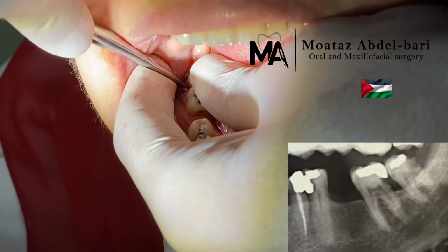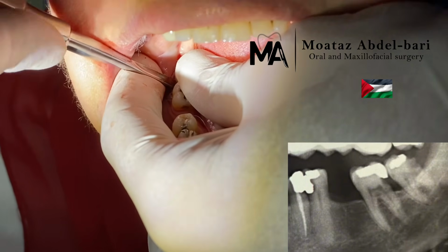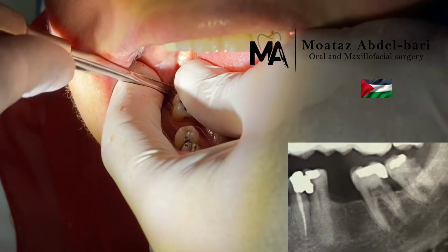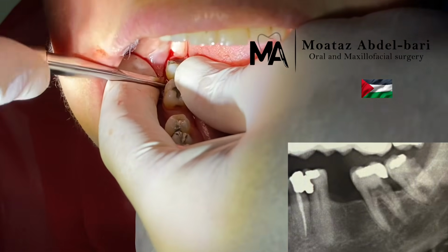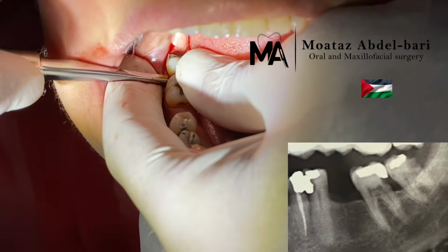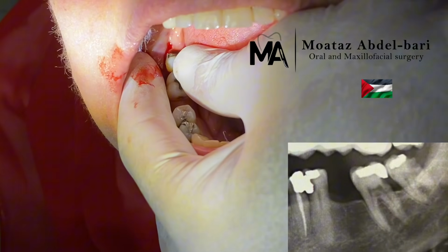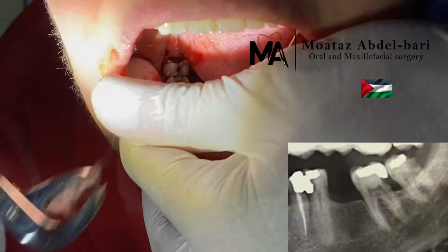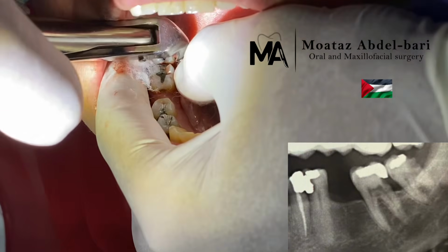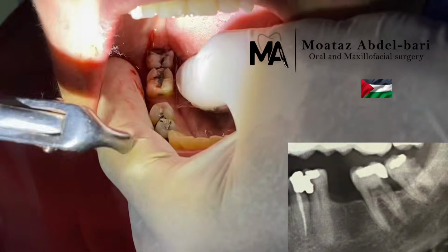And finally I felt luxation from this side, so I place my thumb of non-dominant hand on the occlusal surface to gain as much luxation as possible without fracturing this tooth. You can notice this blood means it is luxated. As you see blood, it is luxated. For this reason, I shifted to forceps extraction.